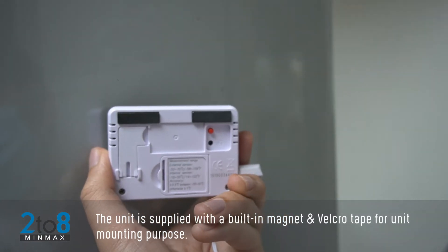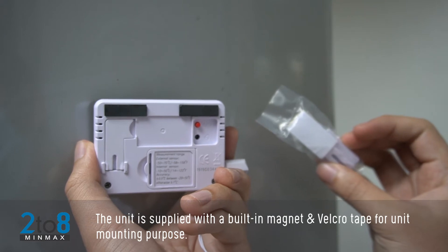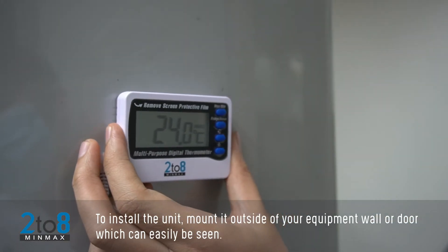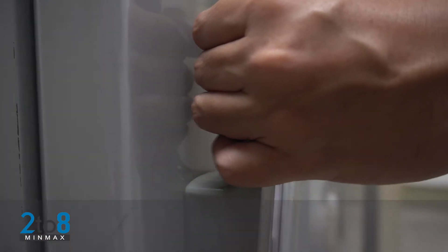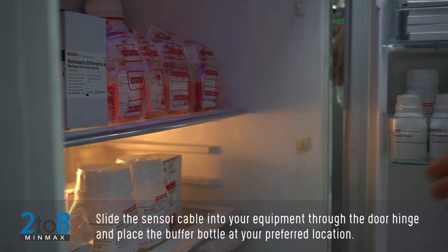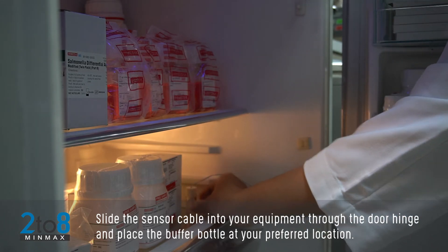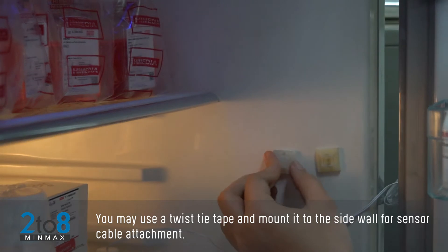The unit is supplied with a built-in magnet and velcro tape for mounting purposes. Install the unit mounted outside of your equipment wall or door where it can easily be seen. Slide the sensor cable into your equipment through the door hinge and place the buffer bottle at your preferred location.